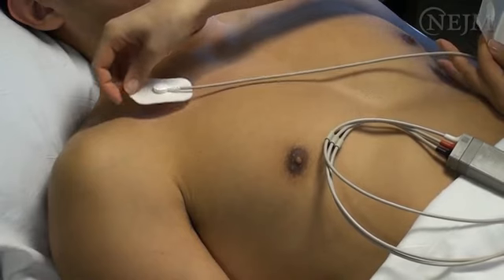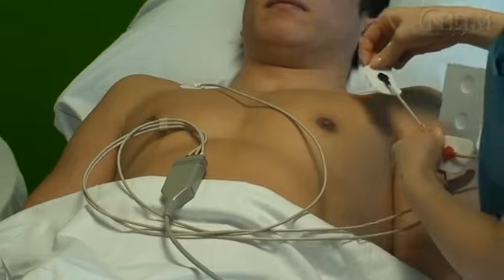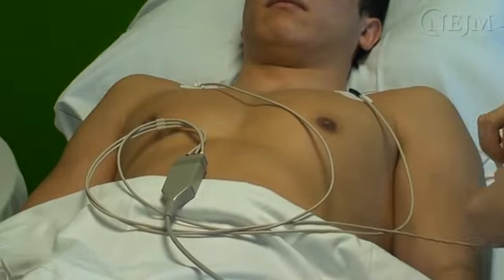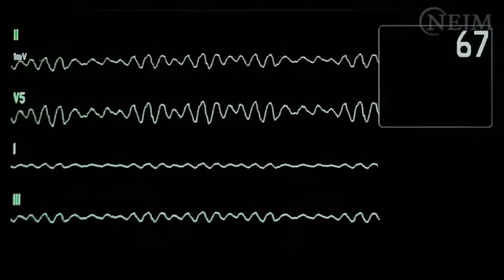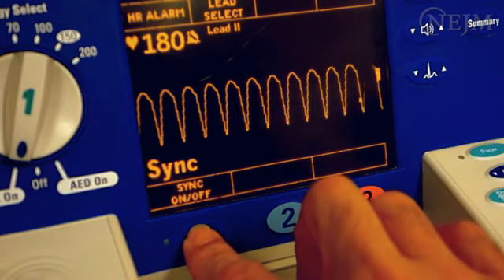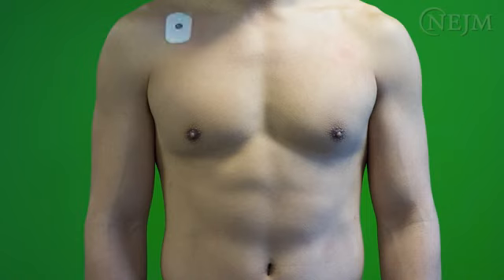A common arrangement is the 3-lead configuration, also known as bipolar lead monitoring, which involves the use of electrodes at the right arm, the left arm, and the left leg to produce leads 1, 2, and 3. This configuration is typically used to detect simple arrhythmias, such as ventricular fibrillation, and to synchronize the electrical discharge with the R wave in cardioversions. However, 3-electrode bipolar lead monitoring is not sophisticated enough to provide diagnostic data for non-basic arrhythmias or ischemia.